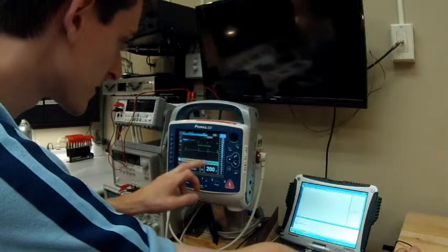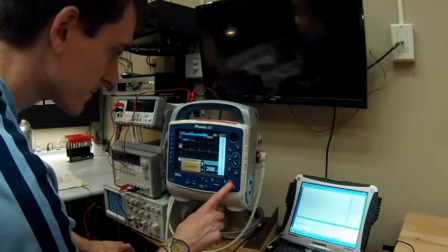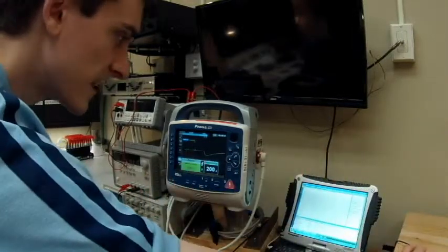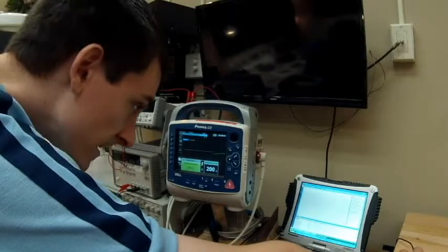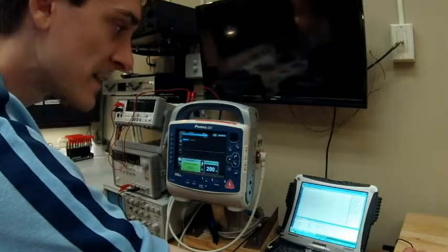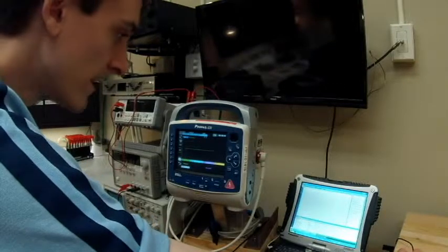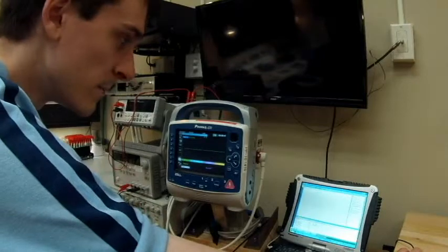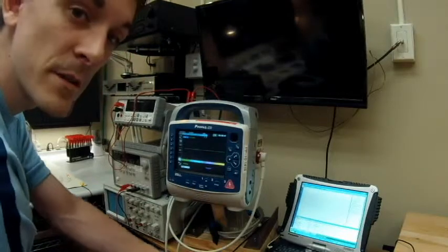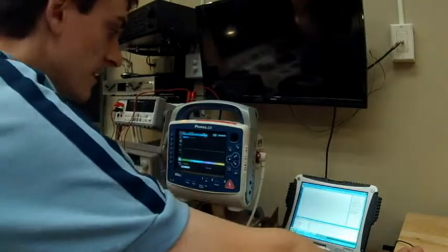It says 'R wave not detected' but it will detect it. It's already detected. It detected the R wave and shocked at 16 milliseconds. This test is looking for how fast it delivers the shock — the high is 60 milliseconds, the low is zero. We hit 16 milliseconds, which is usually the middle point, typically ranging from about 11 to 20 milliseconds. That's good.